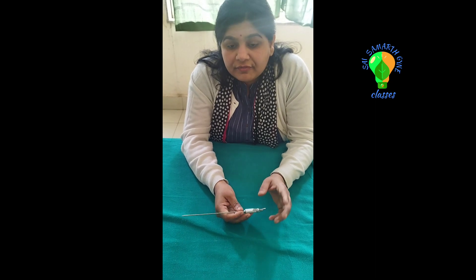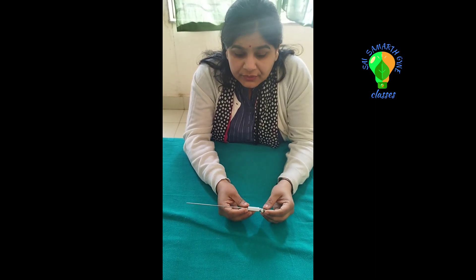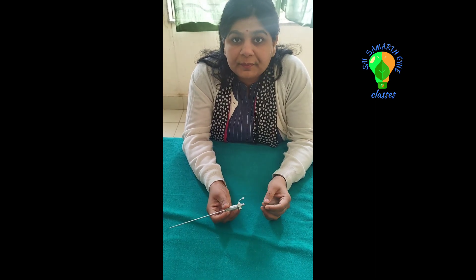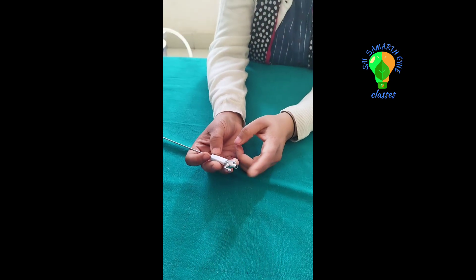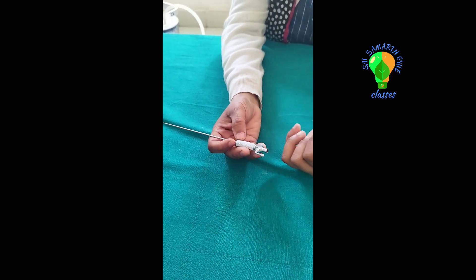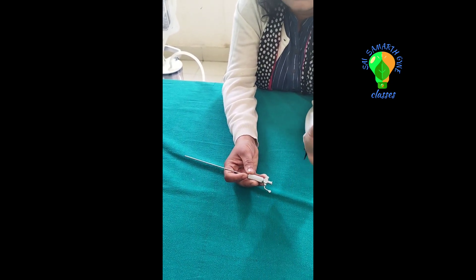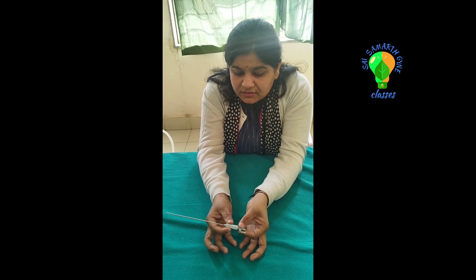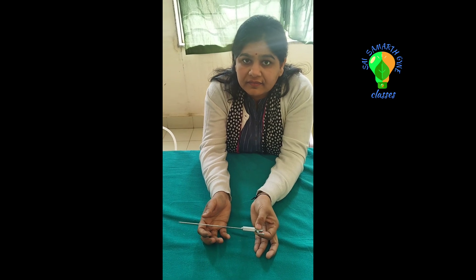Before using the Veress Needle, you have to ensure some points. First, the needle should be patent — connect a saline-filled syringe and flush the needle; there should be free flow. Secondly, you should check the spring action — very important.